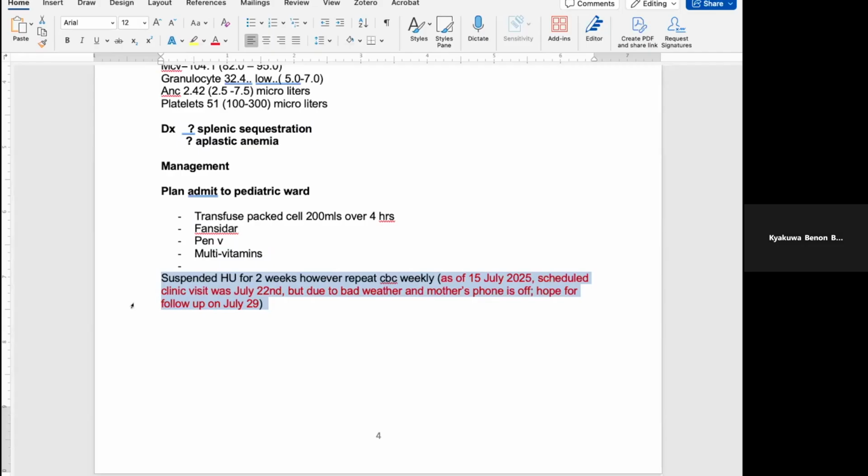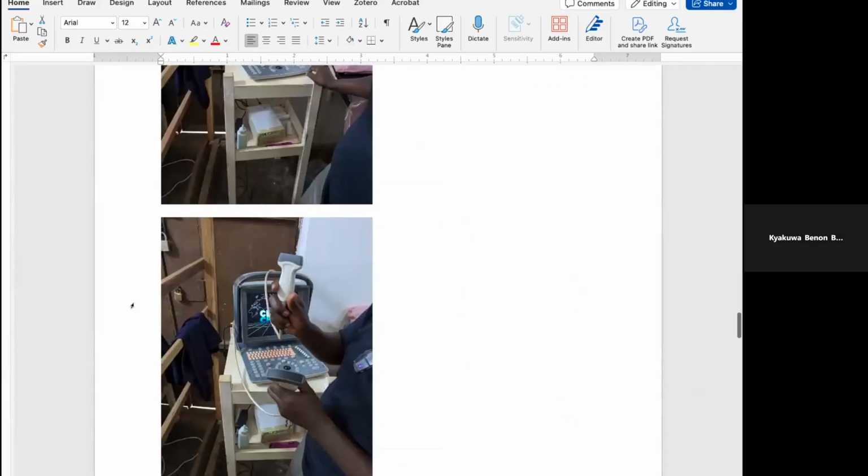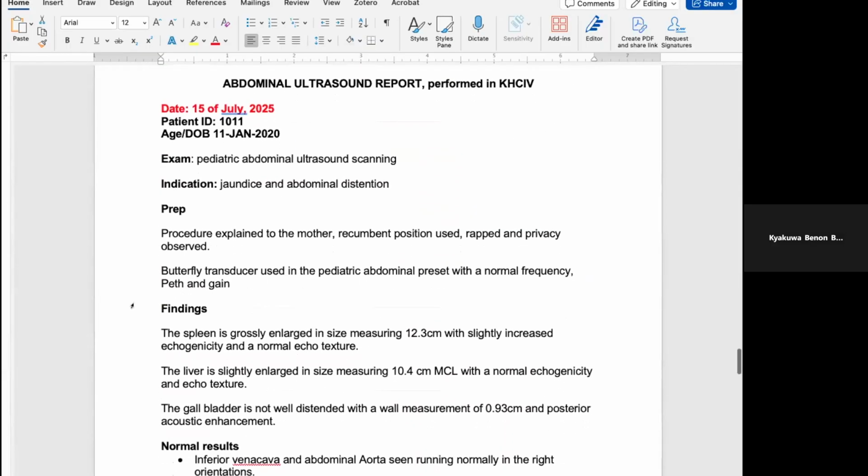We could also look at the alanine transferase levels. Are they less than the upper limit, or do you have normal creatinine levels? And we could also look at the bilirubin levels. And remember, he had severe jaundice, and this one also affected us in our research. Yes, ultrasound scan.